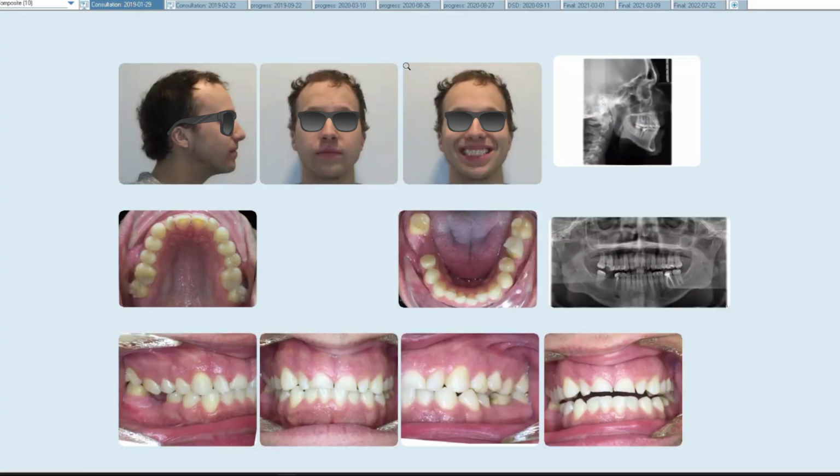Showing a tooth twin can be really helpful because they can see that it's been done on other people and that you're not their first ever case. Even if you are the first ever case, I would pull images of TADs showing cases that were completed, to show these patients someone else who'd been treated with TADs, so they weren't thinking that this was going to be the first time TADs had been used in this way. So I explain, of course, that this is something that's commonly done.